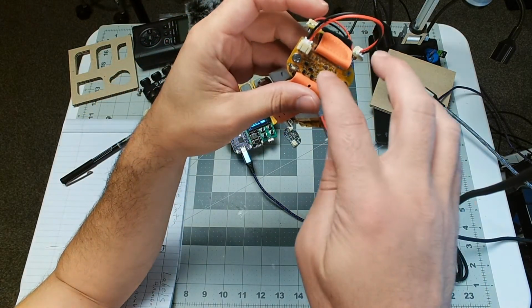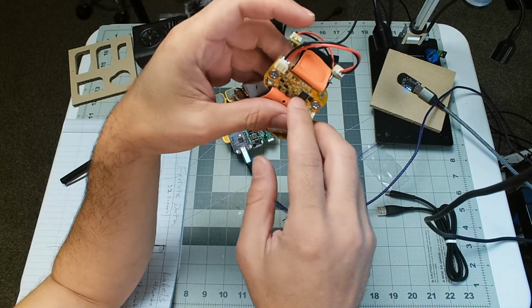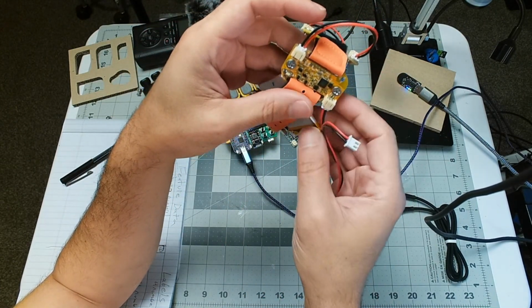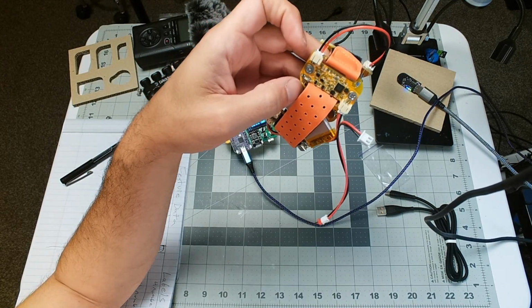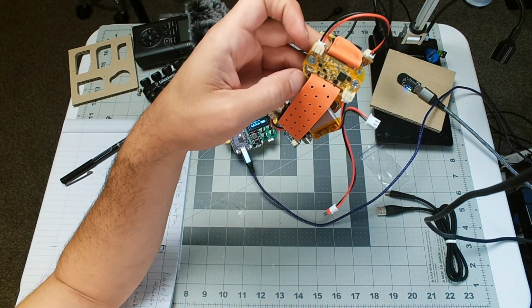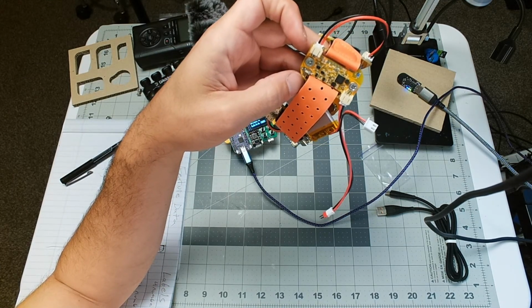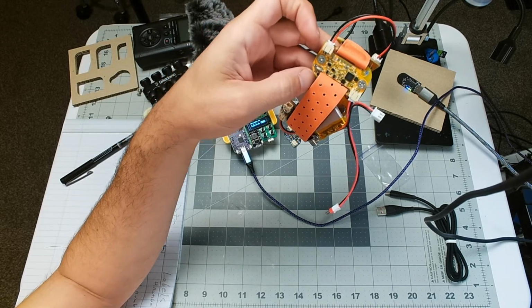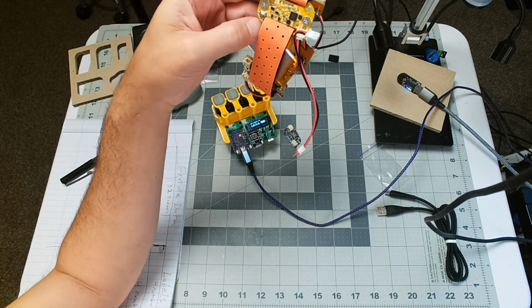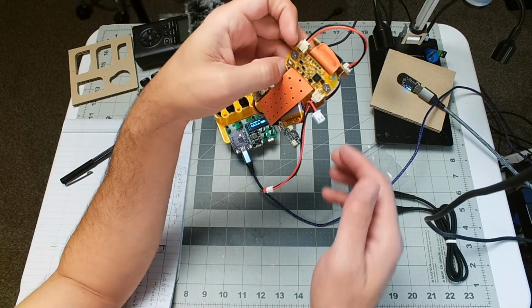But the problem is I don't think these are transceivers, so the only way to communicate with them is with the button. But you could probably solder a third line onto them, or change the firmware so that they just turn on when there's power. Or maybe you can't do that. I'll refer to what the 3DS said.